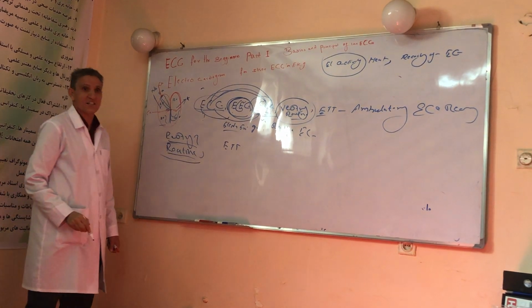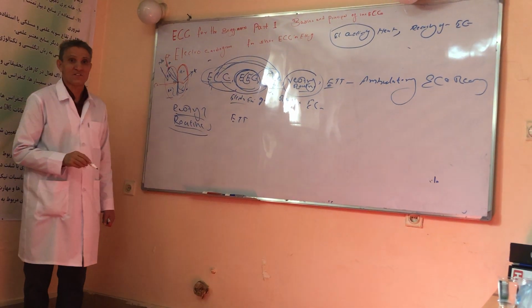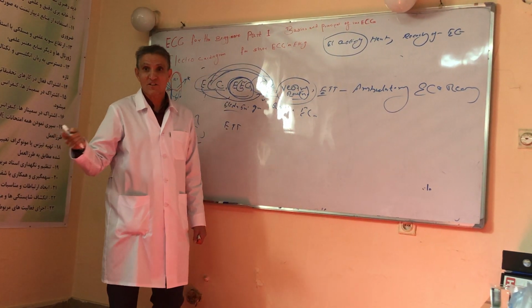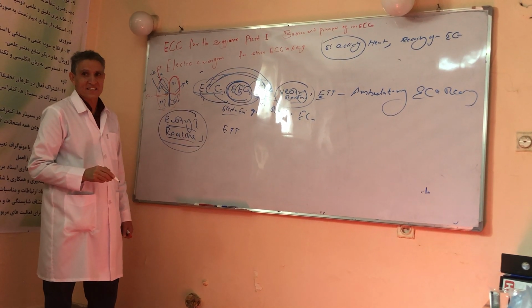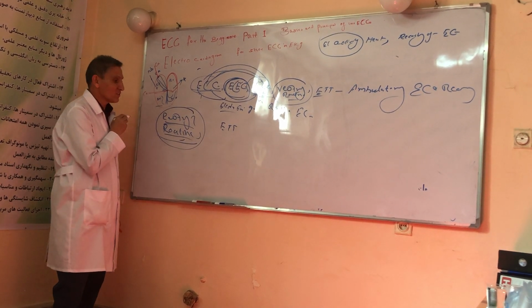Resting ECG is an ECG that we take without asking the patient to exercise. Remember, all those ECGs that we take in our clinical practice, inside the hospital or in our private clinic, are called resting ECG. This has no contraindication. This was about the resting ECG or routine ECG.